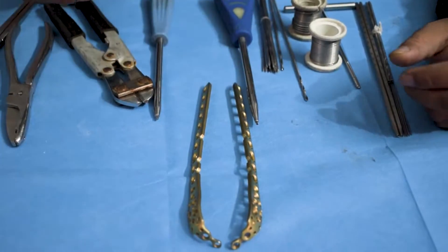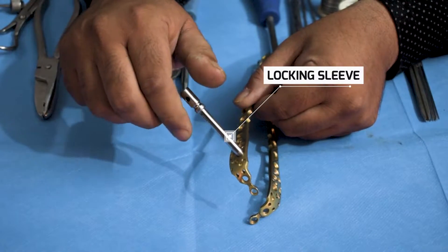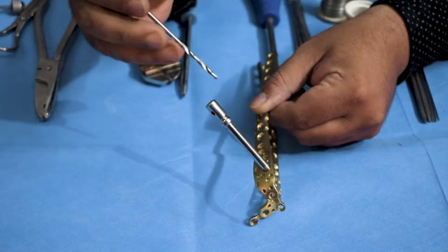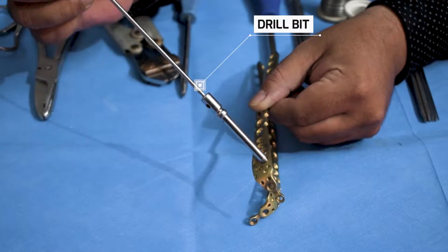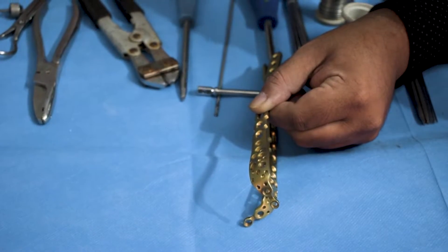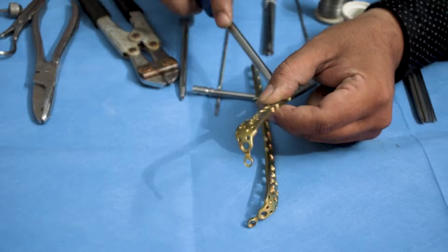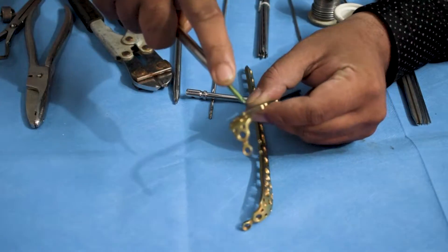First, a locking sleeve needs to be placed in the hole. Once the locking sleeve is attached, drilling is done through it, and then you fix a locking screw in this hole. When drilling through the sleeve, you can only use a locking screw. Then use a screwdriver to tighten up the screw.